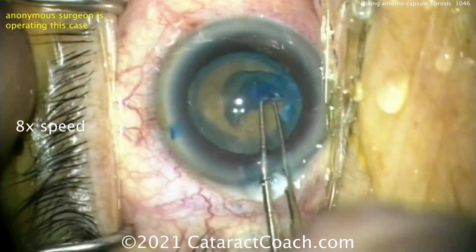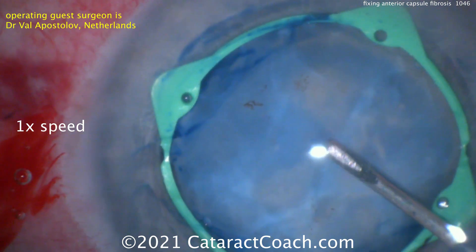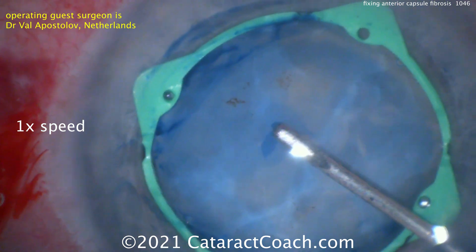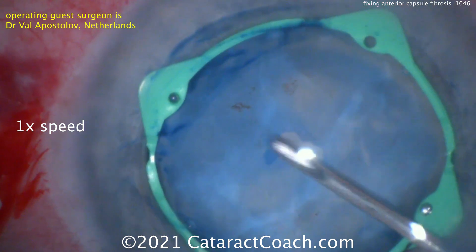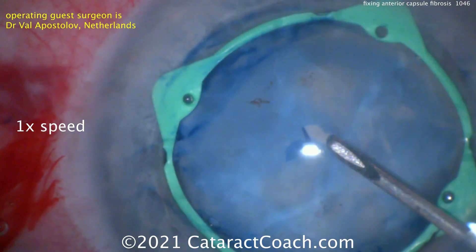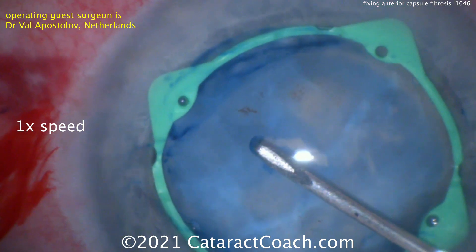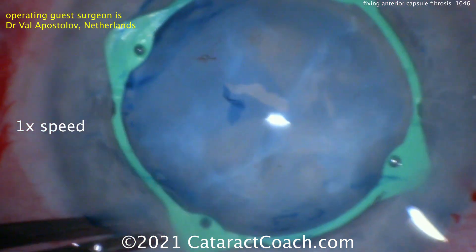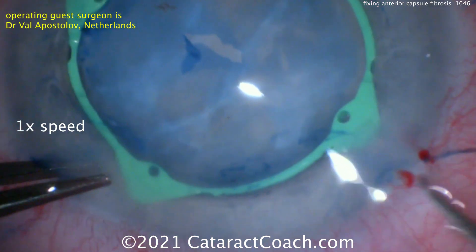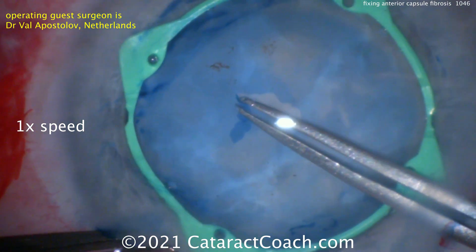That ended up being bigger than we wanted. That was an anonymous surgeon. This is now Dr. Val Apostolov from Amsterdam, showing his technique, which is very different: starting centrally, making a small opening, and dissecting from the center to the periphery. He wants to dissect the undersurface of the anterior lens capsule away from that fibrotic cortical material, because that's what's causing the adhesion.